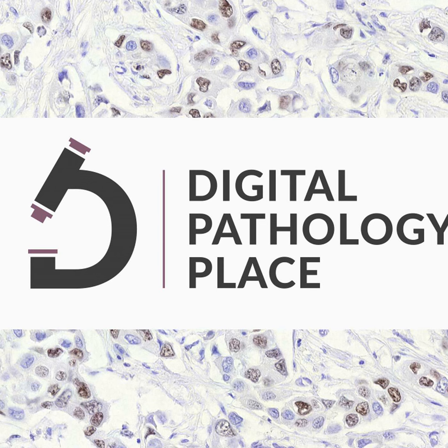B. Telepathology, intraoperative consultation and second opinion consultations. In the realm of telepathology, digital telepathology is playing a pivotal role in intraoperative consultations and providing second opinions. Intraoperative consultations, also known as frozen section diagnosis, are a critical part of many surgical procedures where real-time pathological analysis is needed to guide surgical decisions.